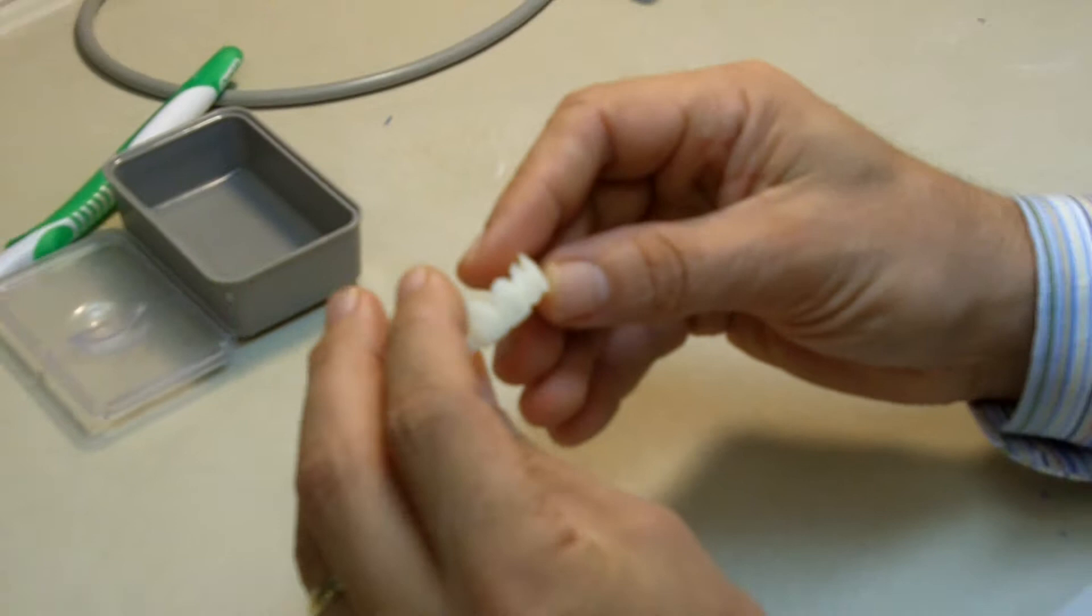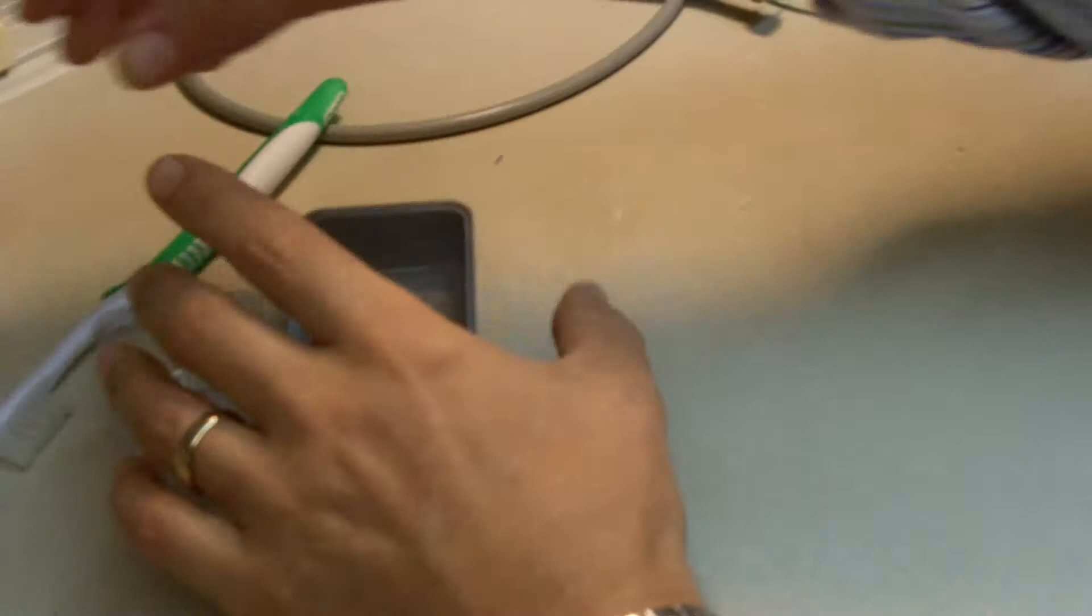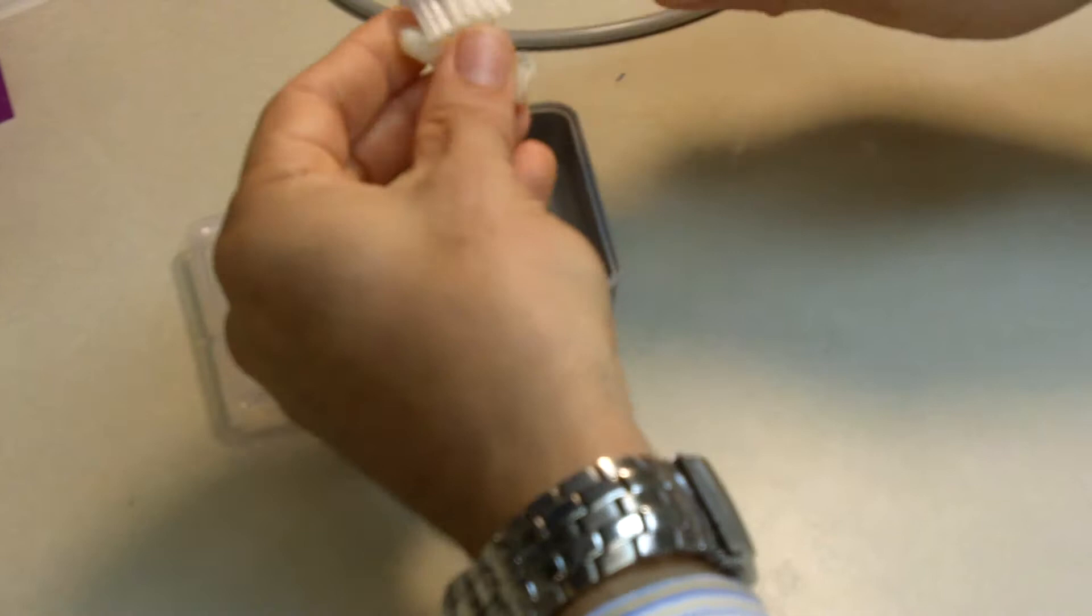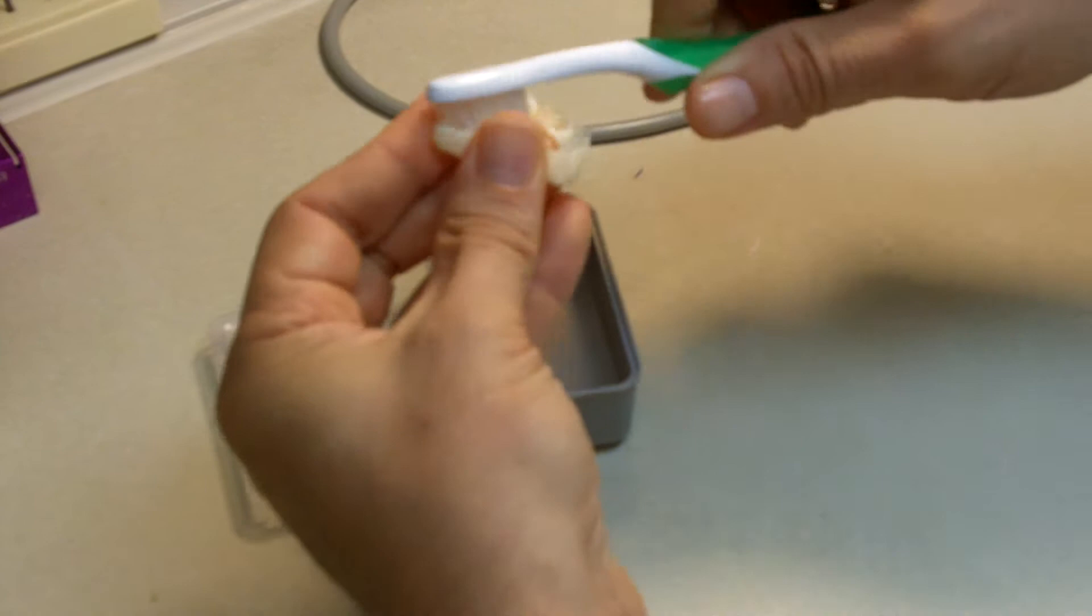I'm going to put this in a little alcohol bath first. I'm pouring the alcohol, just some rubbing alcohol, isopropyl alcohol, and I got a toothbrush. I'm going to brush with alcohol the whole provisional.